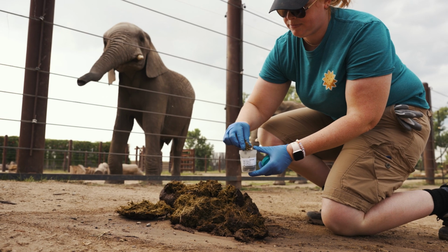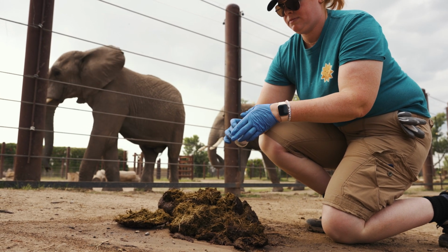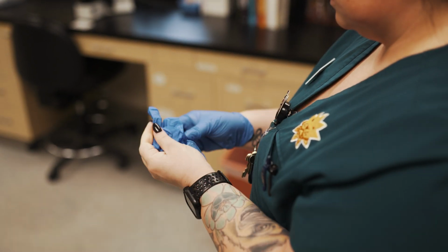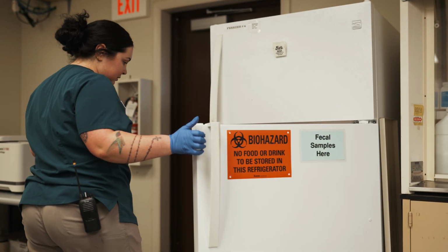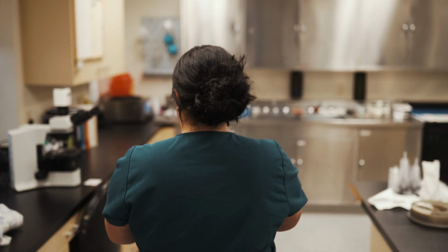When we're asking our keepers to collect a sample, obviously we provide them with the containers they need, but we also need to express to them that if there is a concern for an infectious disease, they need to use the proper PPE. So gloves are an always. Once the fecal sample has been submitted, we ask the doctors what we are testing for. If we're looking for bacteria or something viral or fungal, we have to run different testing versus what we would routinely run.